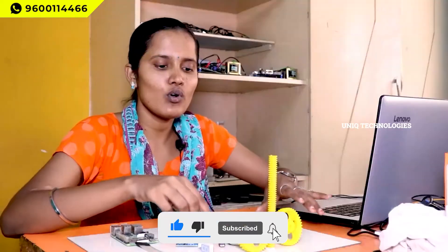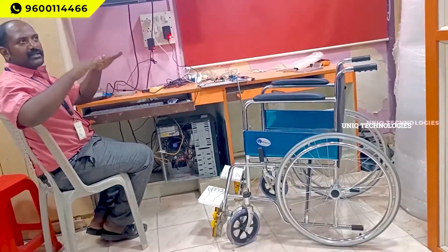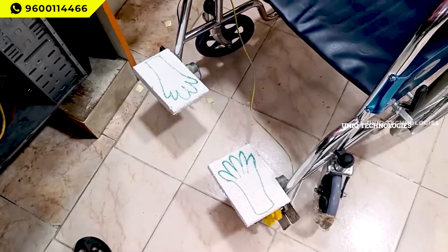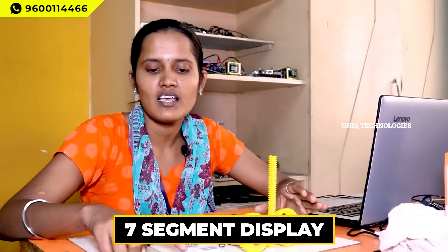This is the gear setup used in the physical wheelchair model. In the output part, we can see the video and wheelchair. This is a 7-segment display — if I press 4, that value is printed here as '04'. If you press 10, it means 10 times, like one complete cycle.